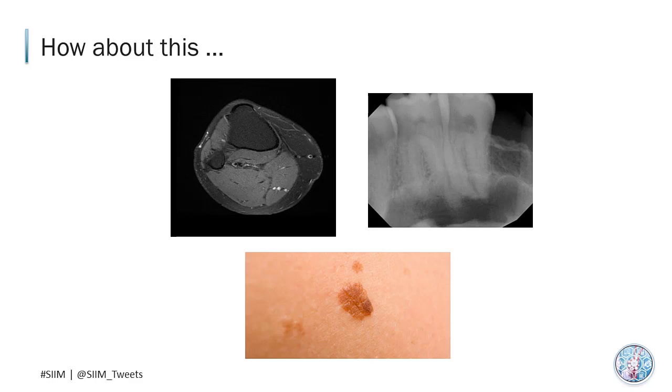To make sense out of the image, you need to know the patient context, like the age or the gender, the procedure used to capture the images, such as a CT brain with contrast, and the relevant body part, like the mole on the left upper arm. There are many more relevant metadata needed in order to understand the context and the specifics of each image. This is where DICOM becomes essential.